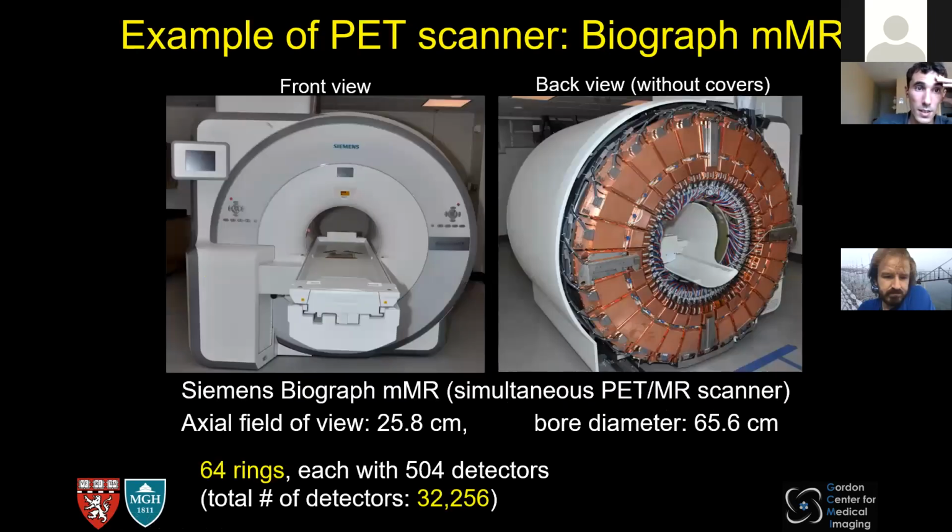This is another type of PET scanner that we're using, especially in research. So this is actually not simply a PET scanner. This is a simultaneous PET-MR scanner. So it's a much more recent technology. So it was commercialized in the early 2010s.